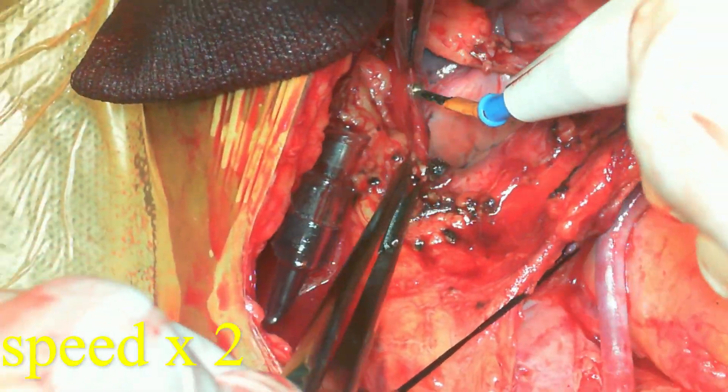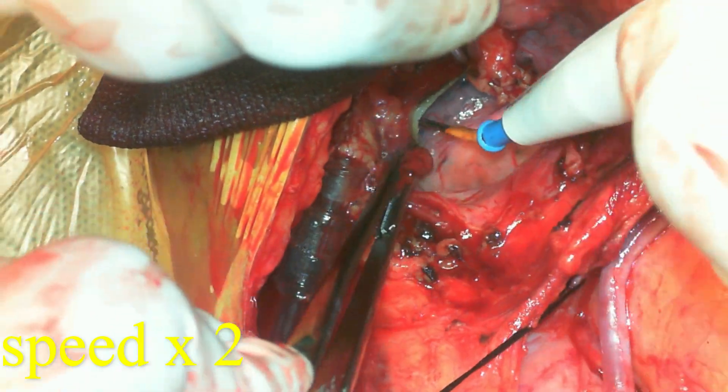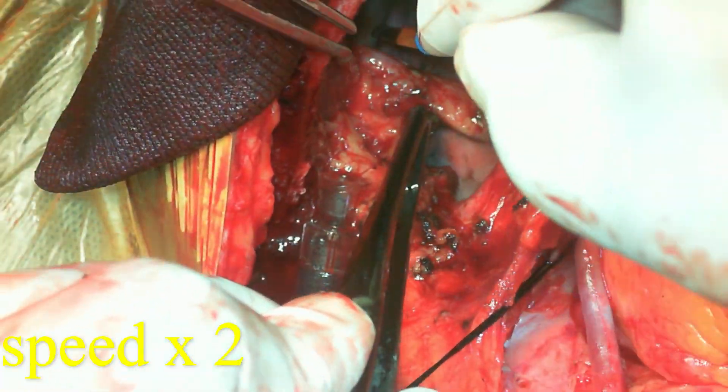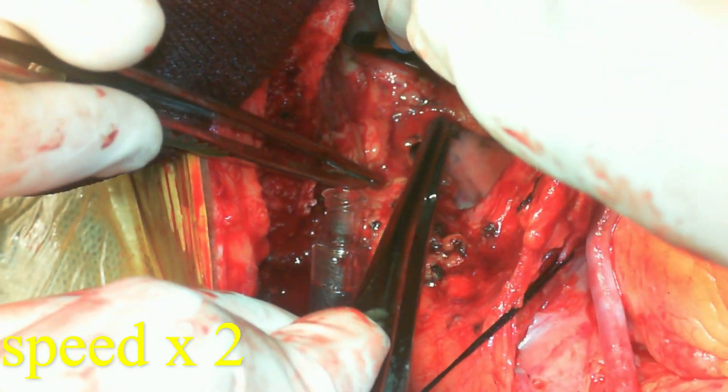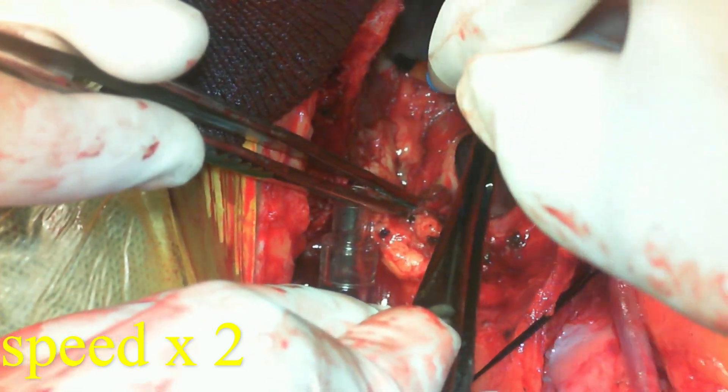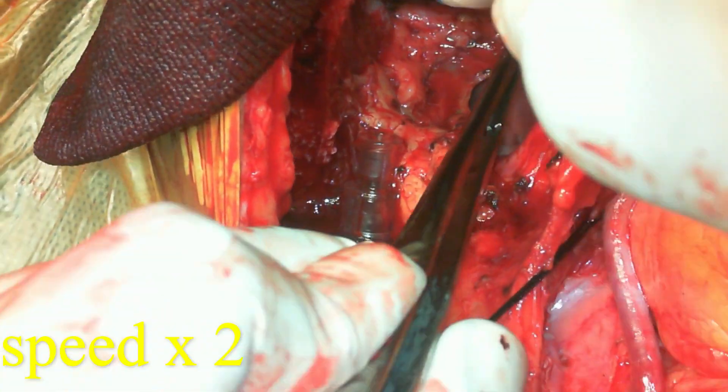I'm trying to harvest that extra inch of the internal mammary artery that is yet to be harvested behind that spur. After doing that, we still find that the LIMA is coursing over the left upper lobe.